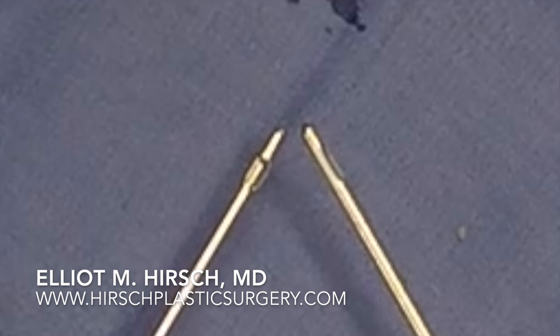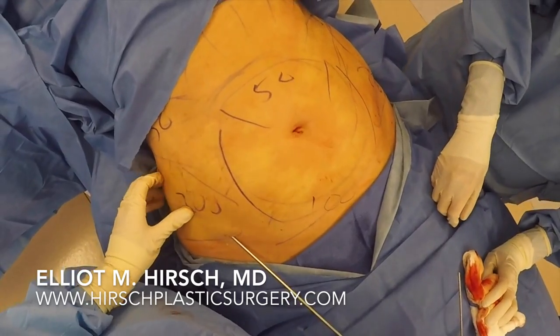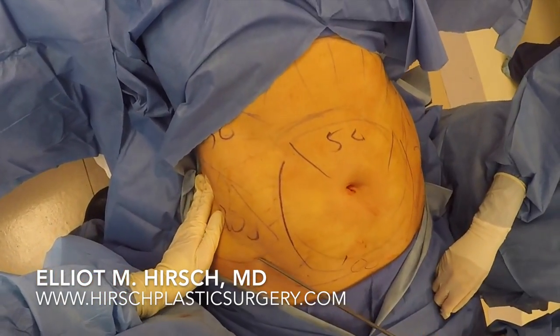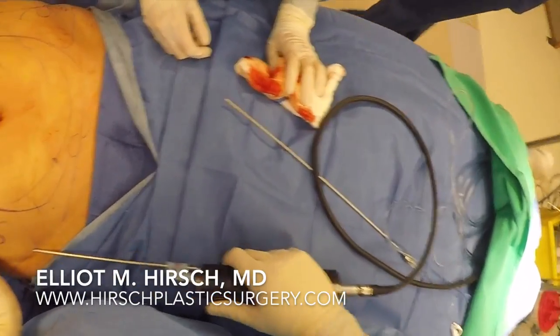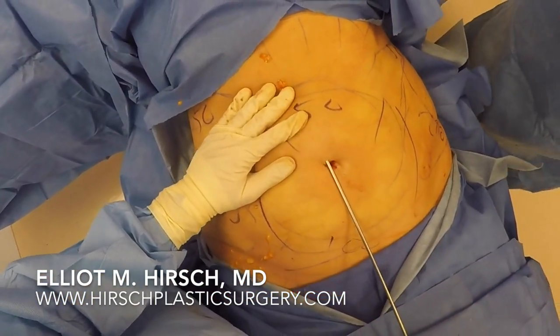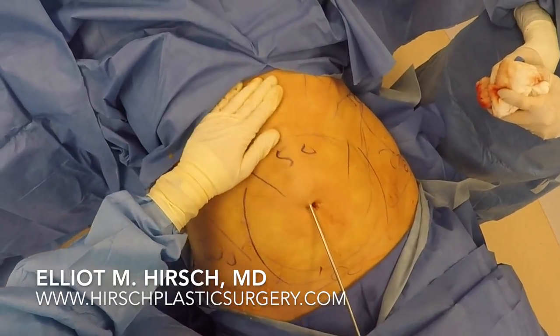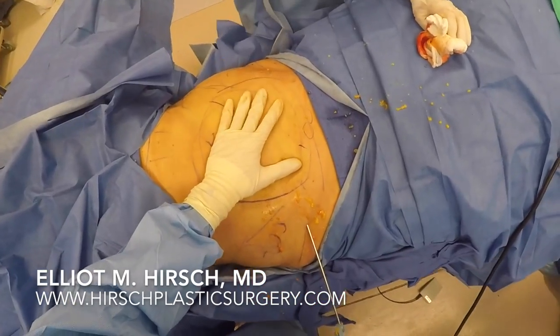We first begin with the exploded tip cannula, which is shown on the left. The standard Mercedes tip cannula is shown on the right. The exploded tip cannula is inserted first and is used without the suction turned on. This cannula is very aggressive and is usually used without suction so that it does not create contour deformities in the skin. By passing the cannula through the areas to be liposuctioned, the fat is broken up and is much easier to remove.